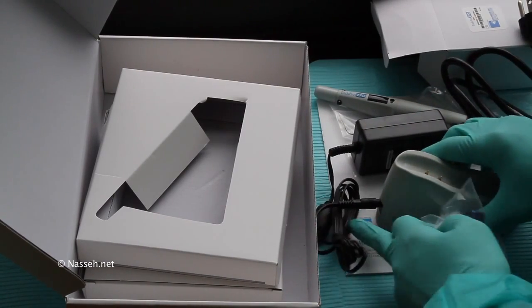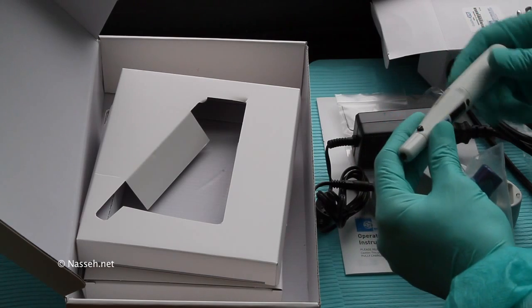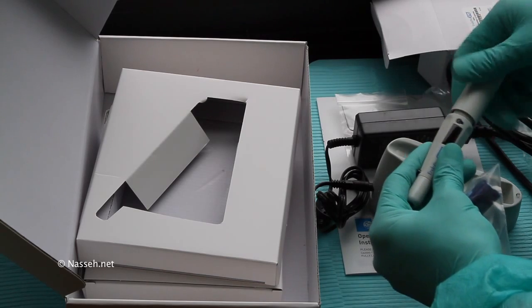First, let's install the battery. The battery comes with a partial charge, but make sure you charge the unit for several hours before use.